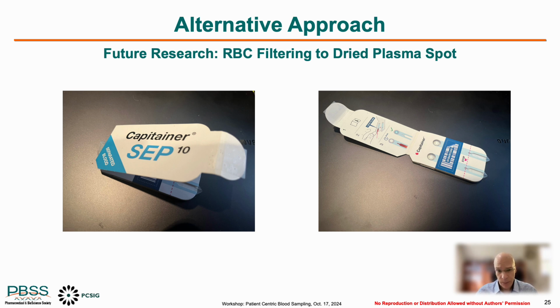Most certainly our lab will be having a close look at this recently introduced technology, understanding its attributes and comparing the Mitra pretreatment approach to that of RBC filtering as it applies to analyte instability when there is evidence of erythrocyte involvement to that drug transformation.